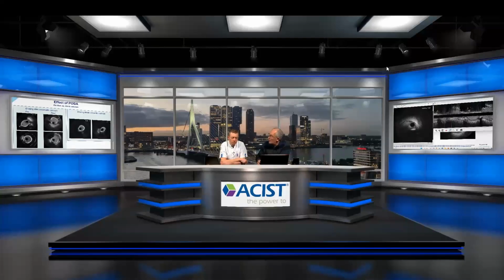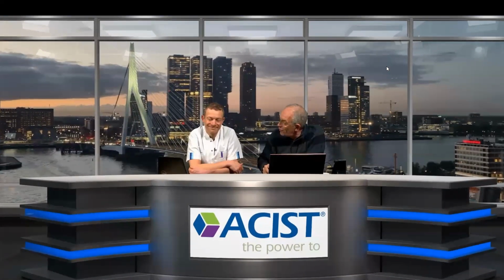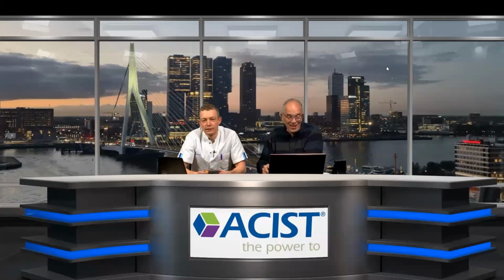The first part of your instrument is your patient that comes with complaints, with your ECG, your blood test, your stress test, etc. That gives you already an indication. I always call that the cardiologist did his homework before putting the patient on the table. And all together with that, you say, well, that's the likelihood. Yes. And we never take things for granted. Actually, not only the physiology, but also not always the imaging. That's correct. You always need to be critical.